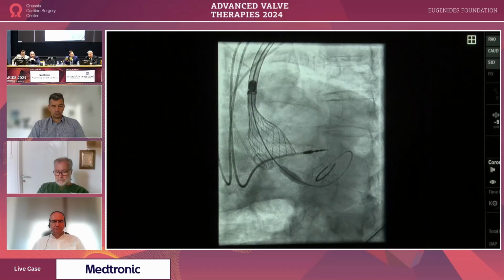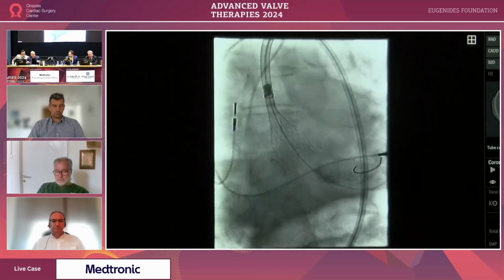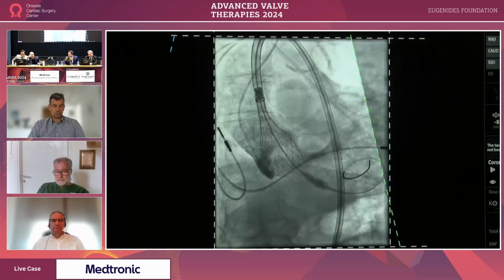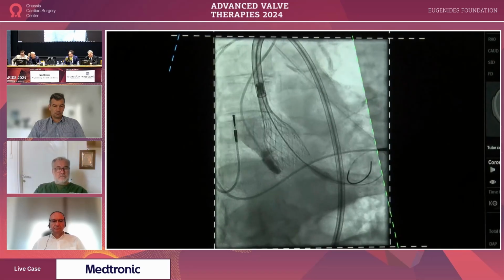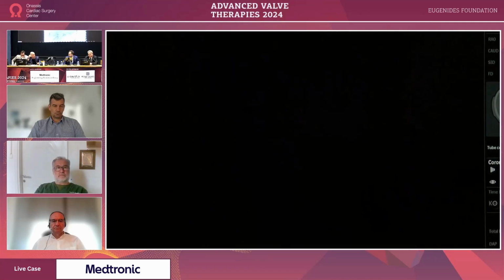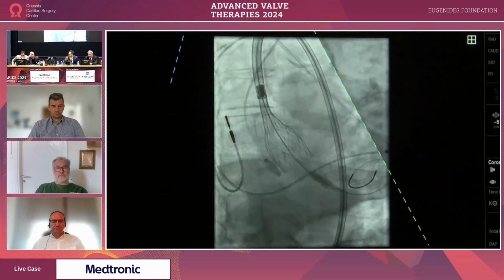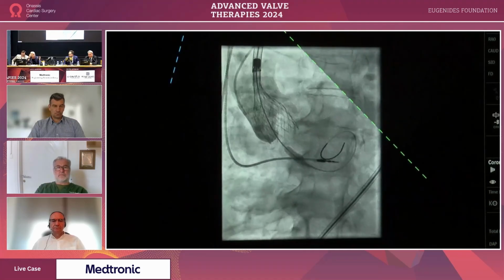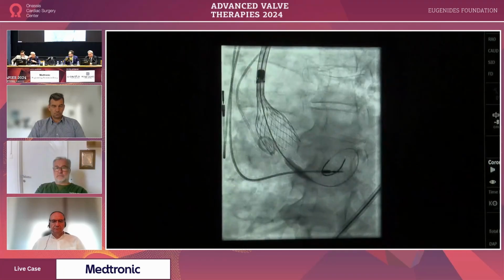And while he's doing it, I wanted to tell you something, guys. The high implantation with this cusp overlap, etc., became the holy grail, the most important thing in implantation. And we didn't realize there is a cost, because in patients that don't have huge sinuses and don't have very high coronaries, the penetration to the coronaries later on is much more difficult.